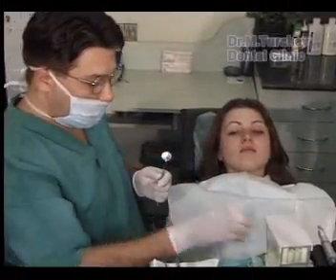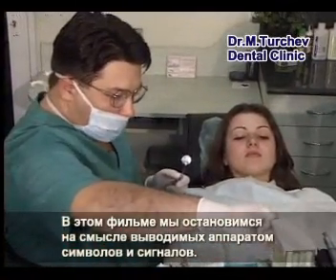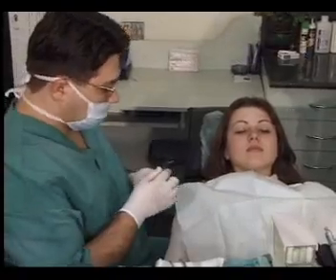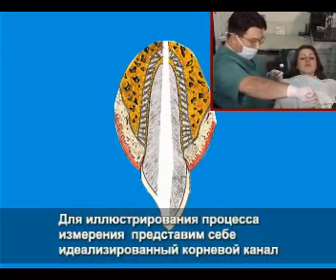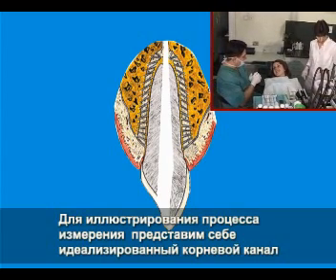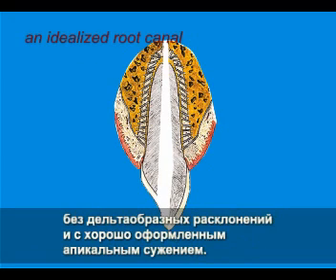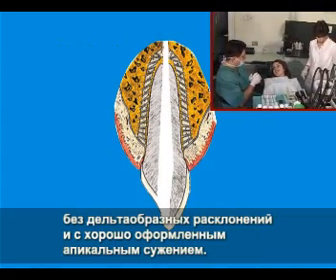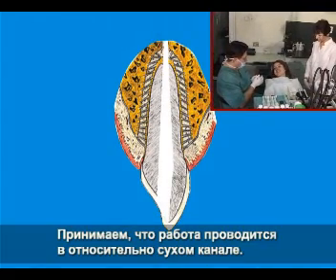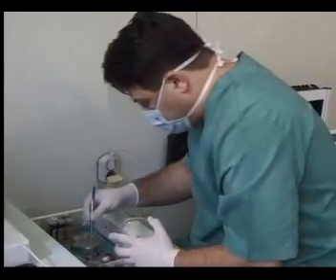In this movie, we will discuss the essence of the symbols and signals the device generates. To illustrate the process of measurement, let's imagine an idealized root canal with an almost round cross-section, without significant curves, without lateral canals, without apical delta, and with a well-shaped apical constriction. Let's assume work will be done in a relatively dry canal.